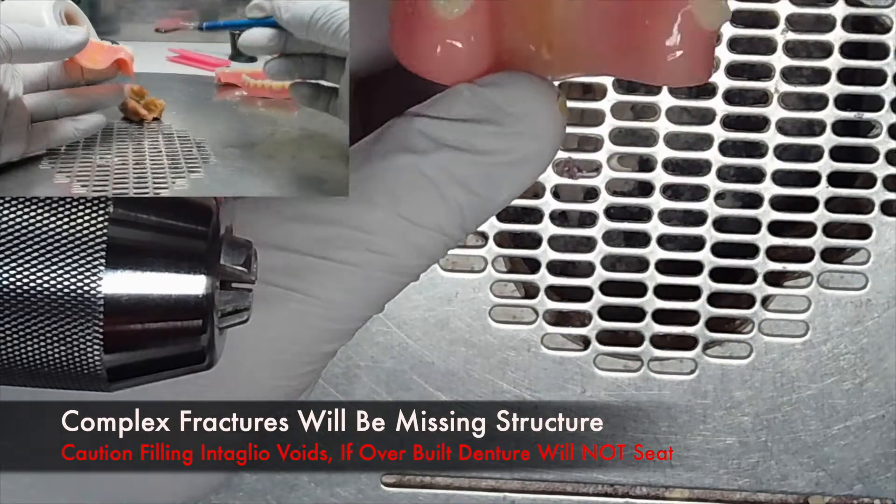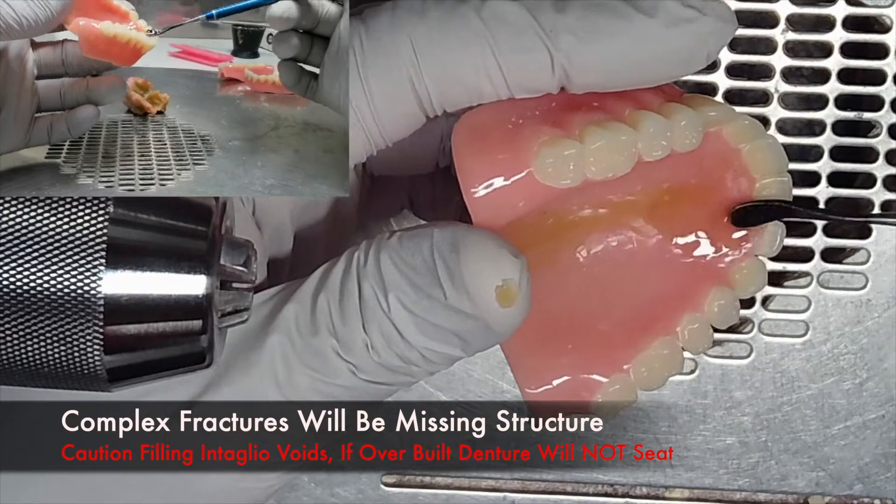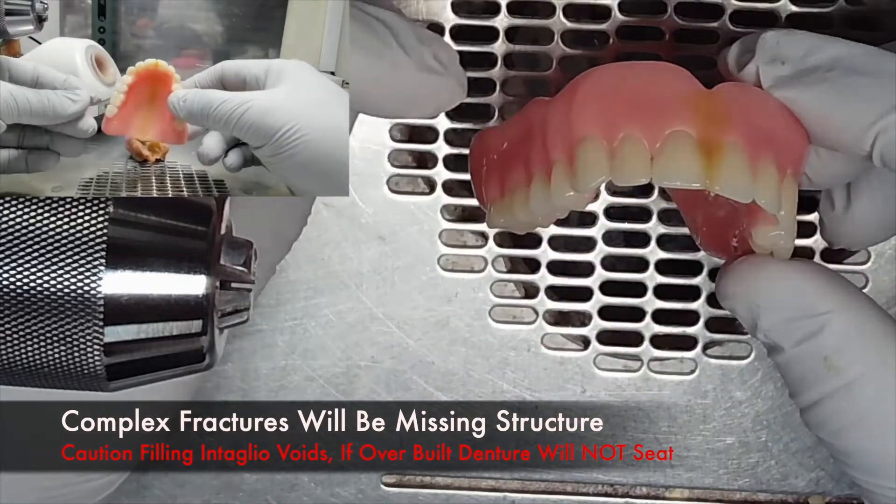When filling those small voids, be careful not to overbuild. If you do, the denture will not seat upon insertion.